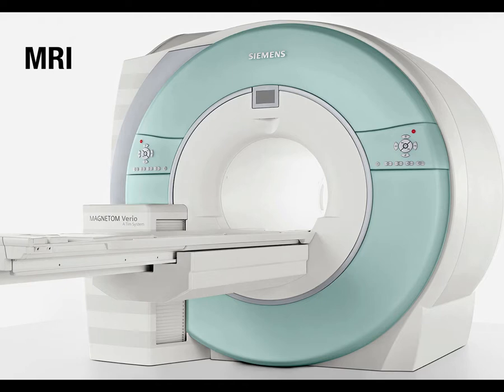So from a safety perspective, again, the magnet's always on. MRI scanners are always in a shielded room, which helps in both ways. It doesn't shield against the magnetic field per se. In fact, what they do is they design the scanner and figure out how that magnetic field drops off with distance and define what they call a 5 Gauss line, Gauss being a measure of magnetic field strength at a much weaker level.